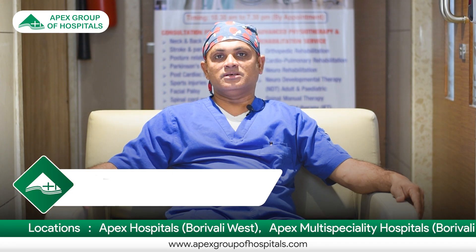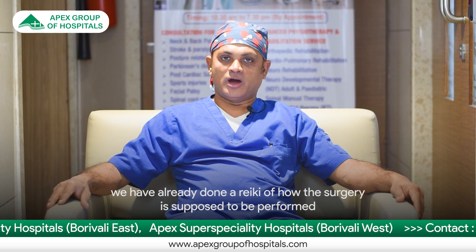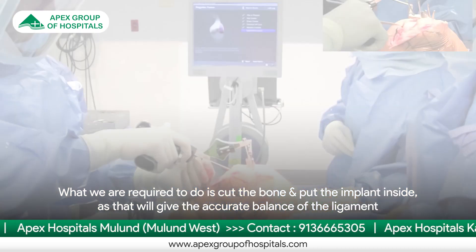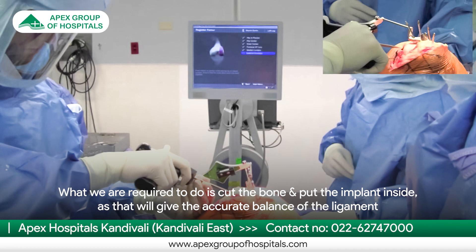When we are doing it with the robot, since the surgery is done on the computer first, we have already done a rehearsal of how we are going to do the knee replacement surgery prior to the surgery. What we now require is to just cut the bone and put the implants inside.